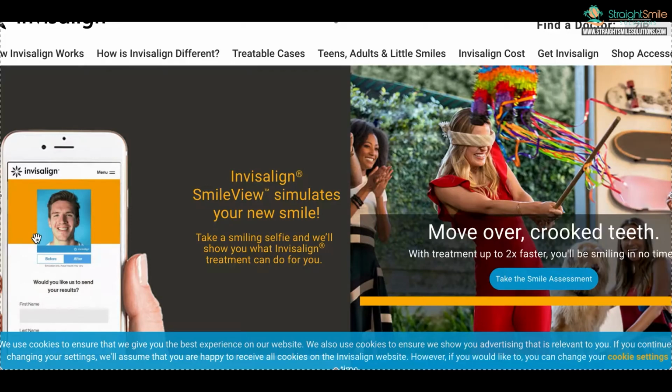Now, unfortunately, there's absolutely nothing I can show you right now because it's still in beta mode, and I did get trained. I did go to their webinar training today, but as part of the terms and conditions, I'm not allowed to show you what I saw today. So sorry. I'm just going to be talking and giving you my thoughts and everything.